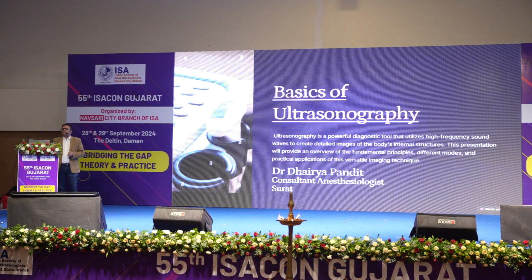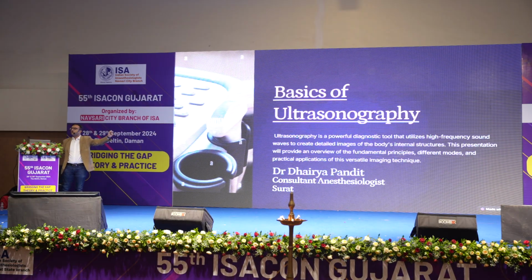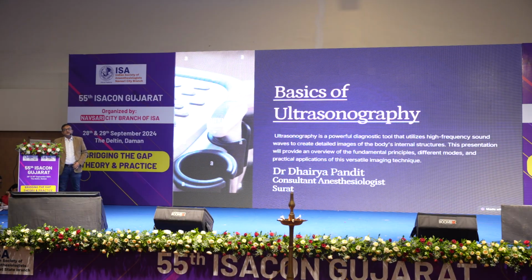If I give you an example, in a dark room you are walking 4 steps forward, 2 steps right, 1 step forward, and you reach some object. That is like a blind block. If that object is making some noise and you reach it, that can be like a PNS guided block. And if in the room there is a focus light and you just go and find that object, it is like a USG guided block.